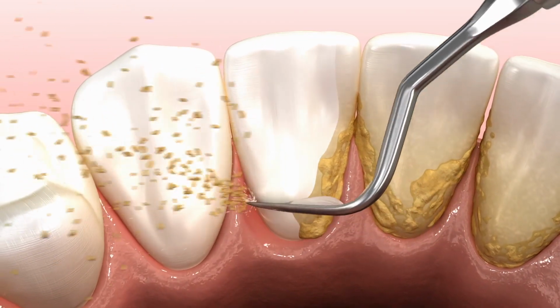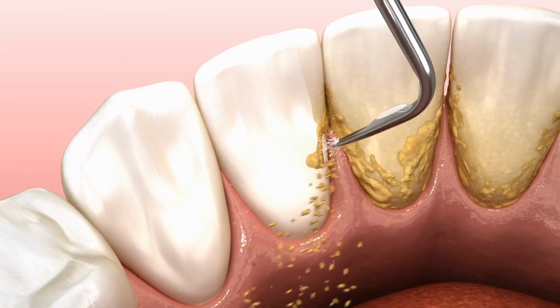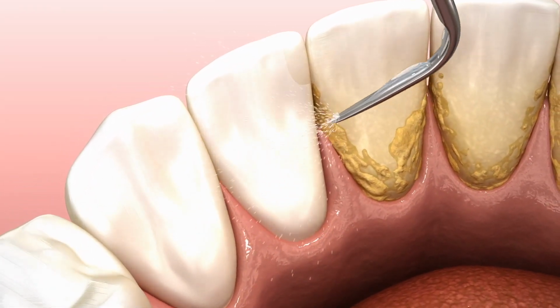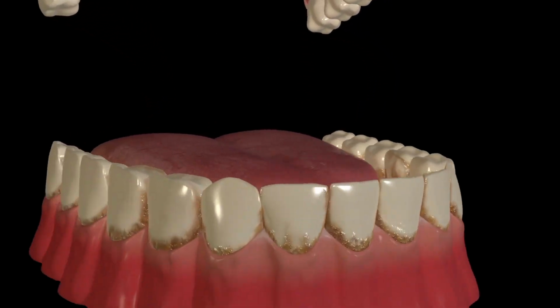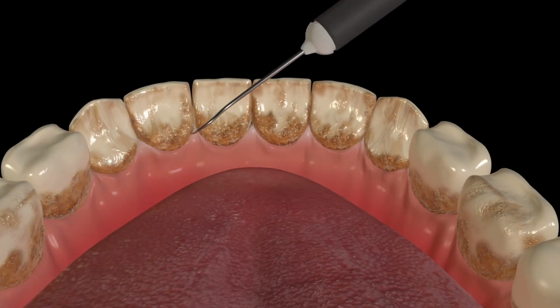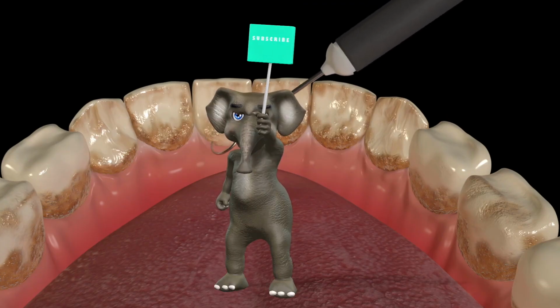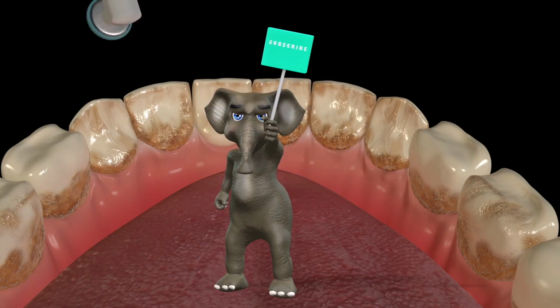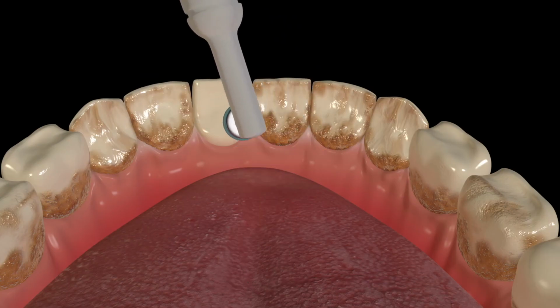In the United States, dental hygienists and dentists begin the cleaning process by thoroughly examining your teeth and gums. The first step is scaling, which involves the use of ultrasonic instruments that vibrate at high frequencies. These devices break apart and remove tartar deposits from above and below the gum line. Water is sprayed continuously during this process to wash away debris and keep the area clean.